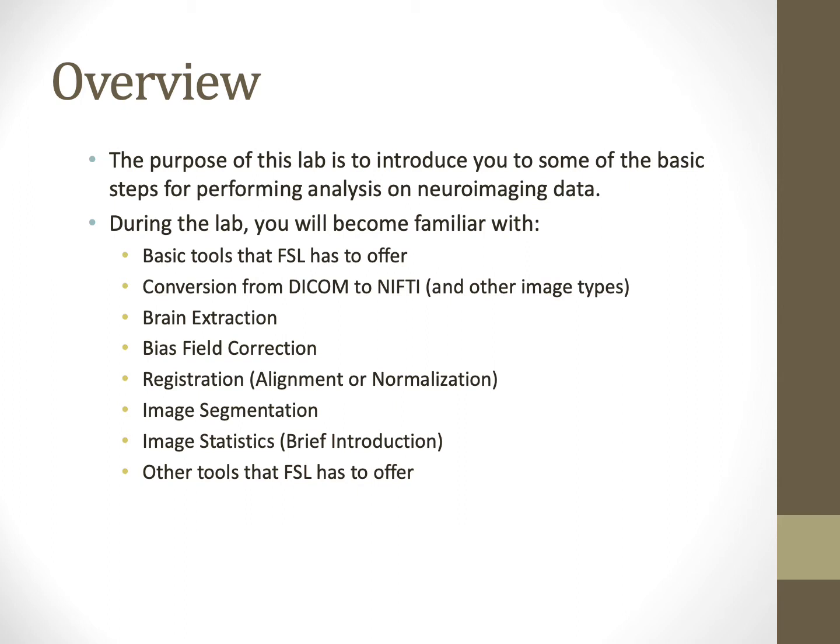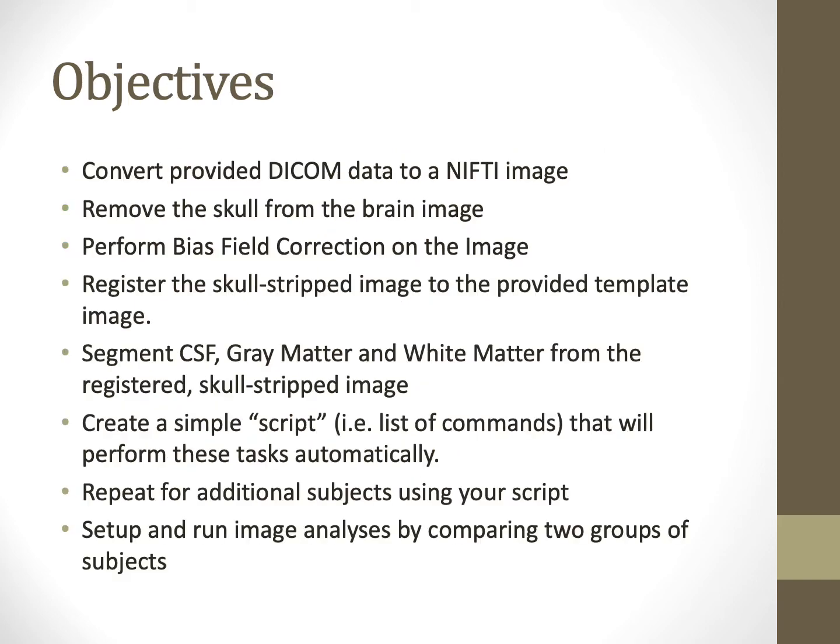Specifically, we'll cover how to convert images from the DICOM type, which comes from the MRI scanner, to the NIfTI format, which is a standard format used by neuroimaging packages. Remove the skull from brain images, which is also known as brain extraction or skull stripping. How to correct for bias field inhomogeneities. How to register two images to one another. How to segment brain images. And how to perform statistics on a set of images. We will also go over other useful tools and commands that FSL has to offer and that we will use throughout this lab and in other labs.